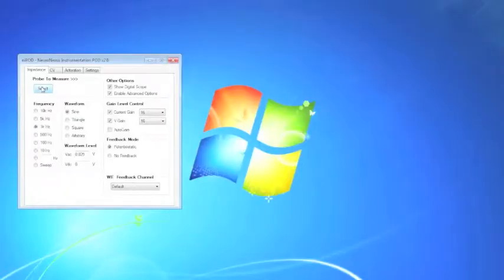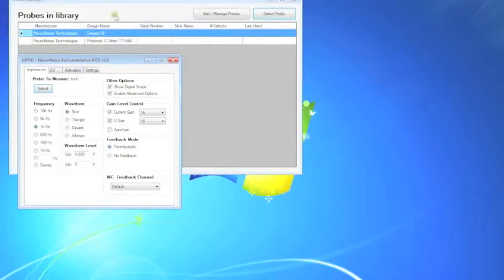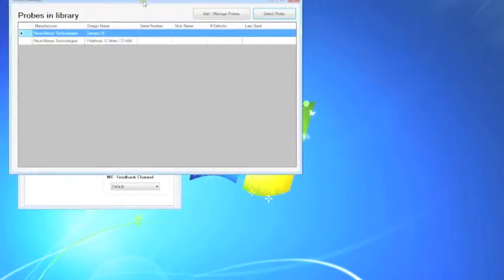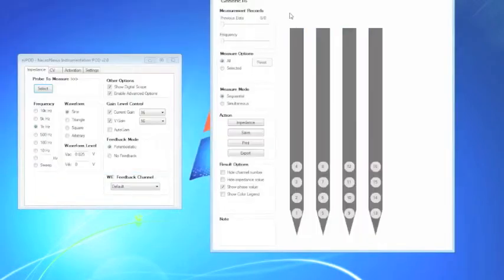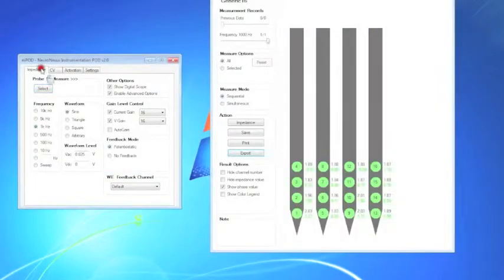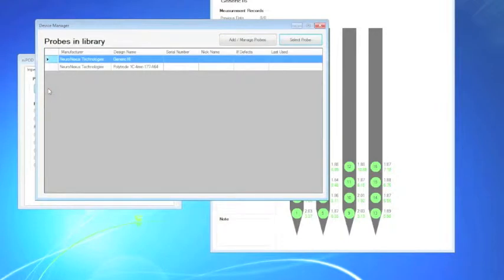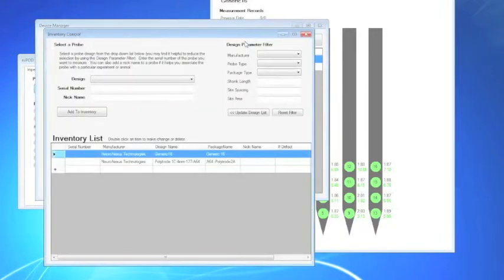This is what the main Nipod user interface looks like. First, select a probe by clicking on select, select probe, and then the probe visualization interface will pop up. You will need to add each probe to the Nipod database so that you can keep track of the measurements.